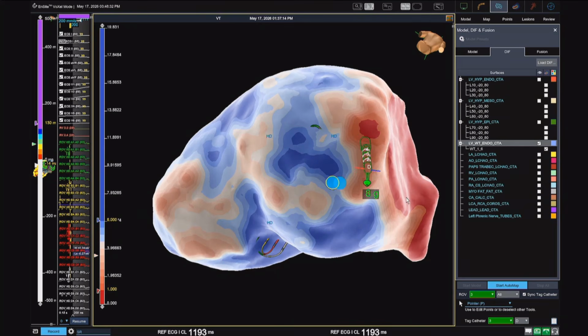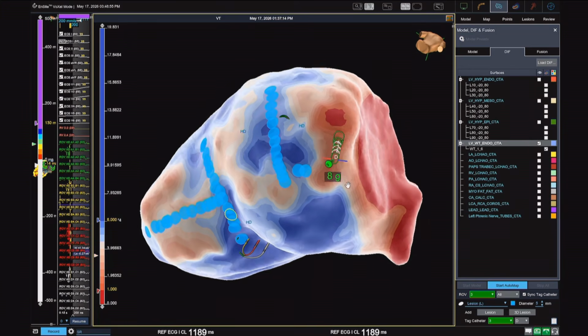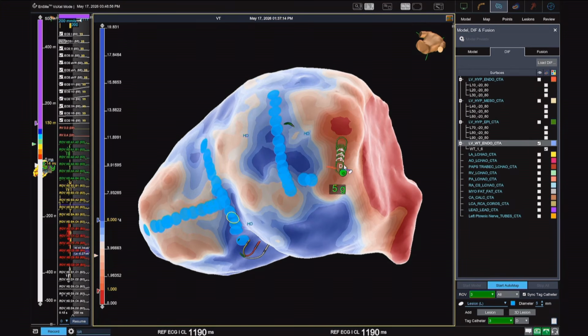So here we have like 2 potential channels. Maria, can you put some drawings in the channels, because I don't know why they were not exported. So this could be one channel, okay? And the other one could be the other channel, and probably one in the apical region, the vertical one. Exactly, okay? So these 3 channels. And where I am now, it's also another channel, this vertical one, exactly.